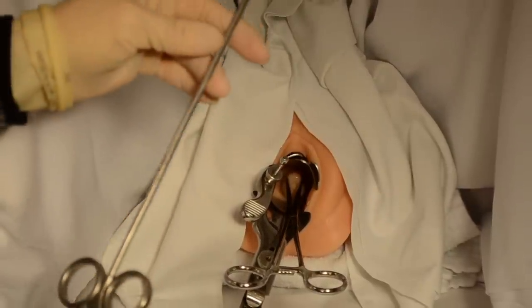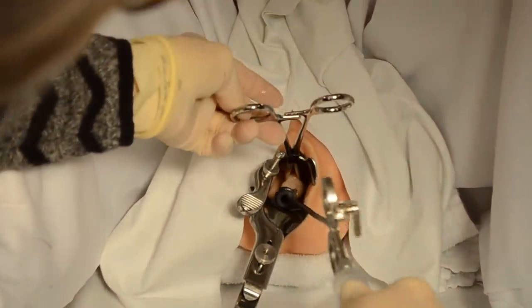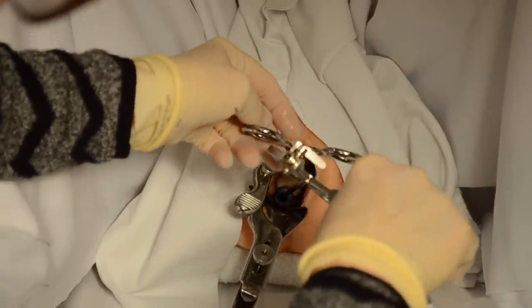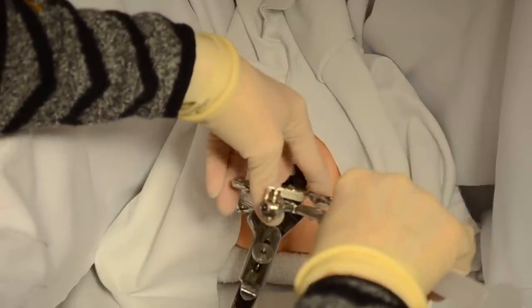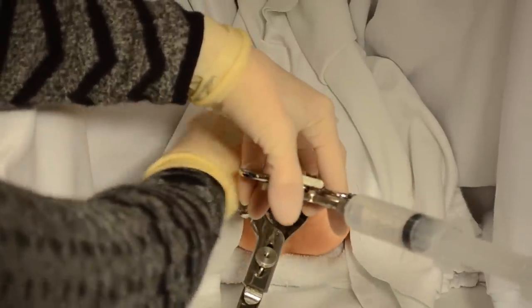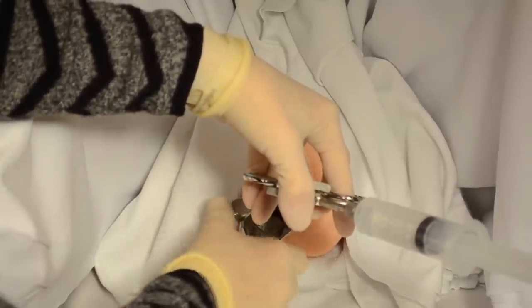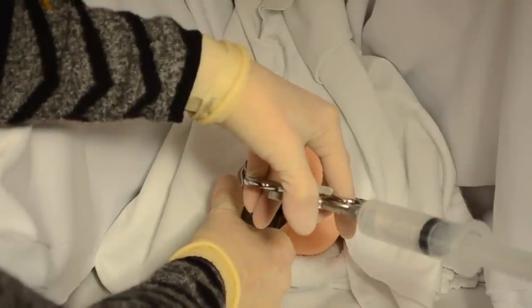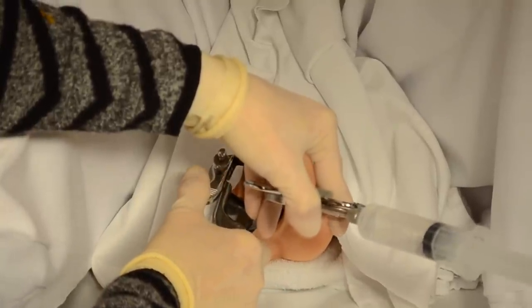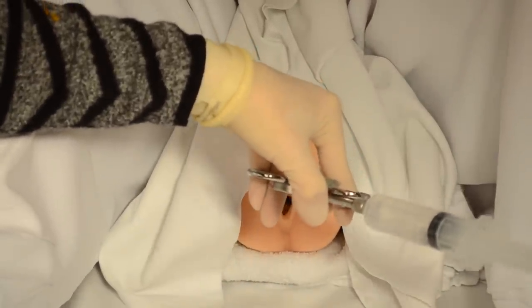My cannula is in my dominant arm. I'm going to do this so that I can see the opening of the cervix when I'm putting the cannula in place — that's really important. Then I want to hold this instrument in one hand while I remove the speculum, because if you remove the speculum the patient will be much, much more comfortable. This is a sidearm speculum where the sidearm is open, so they'll feel me move the speculum. It always feels like it's kind of glued in place, but it can work its way around the instruments.